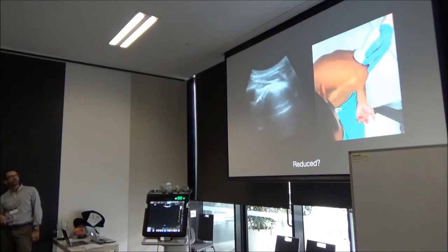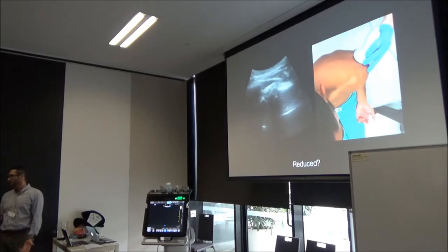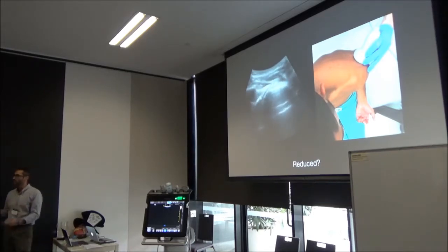And these are great views. I purposely don't use perfect views because you want my providers to be comfortable saying, yeah, it's clearly in. There's rotation, you're rotating it, and they rotate right at the end. You'll see at the end they'll rotate it. Right there. That means it's in. And once it's in, you're done. Get the x-ray, whatever you want to do, however you play your game in your hospital.